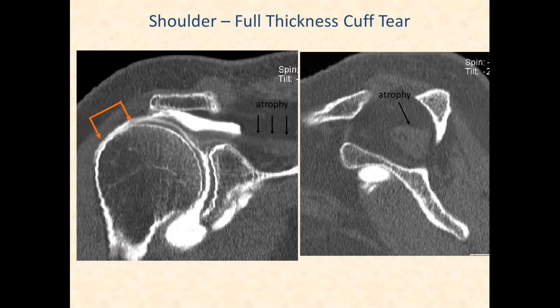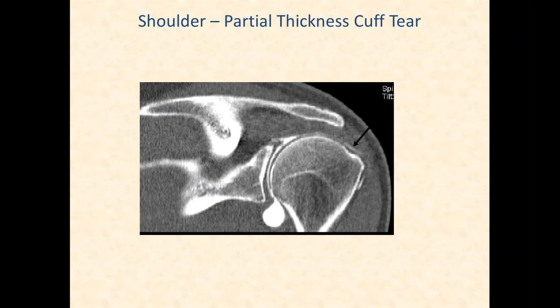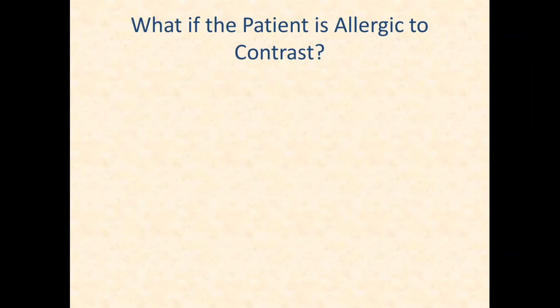CT arthrograms are not worthless. Here's an example of a full-thickness supraspinatus tear — the tendon is completely torn, the musculotendinous junction is medially retracted, and the muscle belly shows atrophy and fatty infiltration. To evaluate the supraspinatus, draw a line across the acromion — the muscle belly should reach that level or above. Here's also an example of a partial undersurface tear, likely at the supraspinatus-infraspinatus junction. CT arthrograms are also helpful for labral tears.